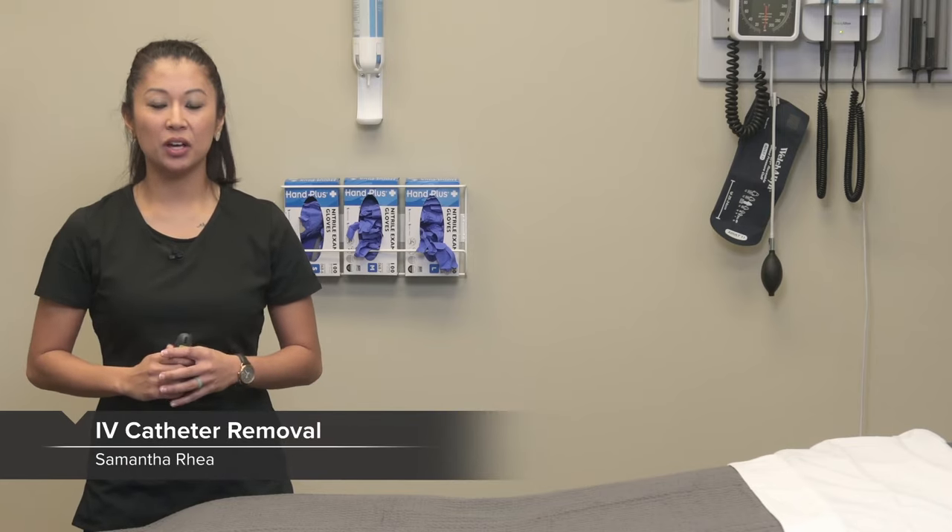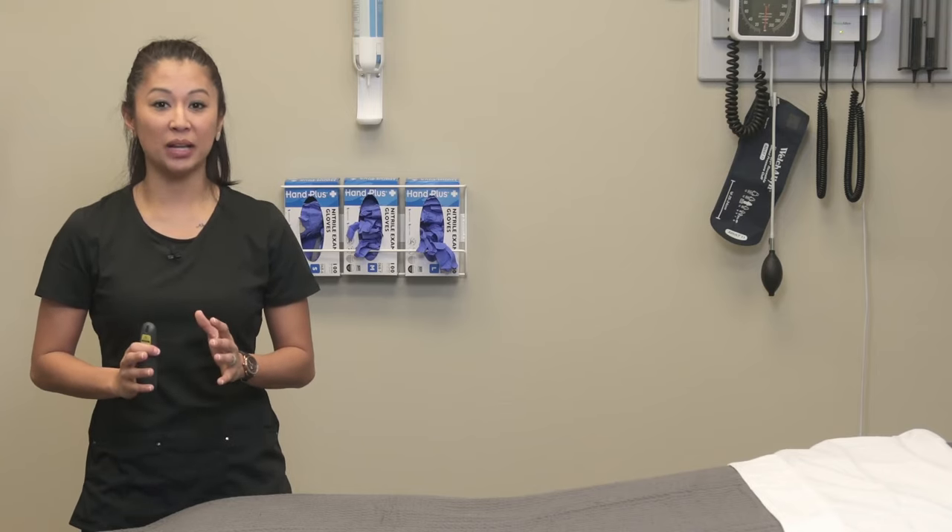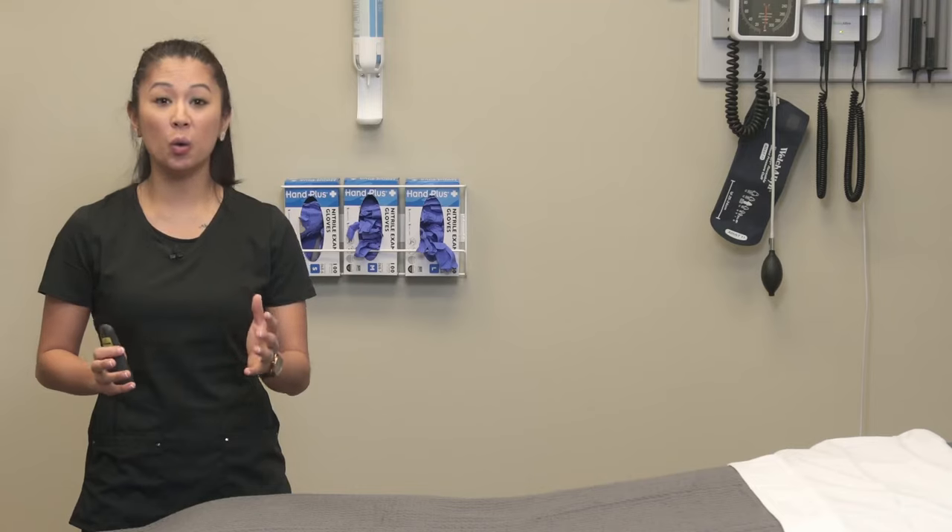Let's look at the skill of removing an IV catheter. You may also hear this referred to as discontinuing or DC-ing an IV catheter. This typically takes place when treatment is completed or the patient is discharging to home.